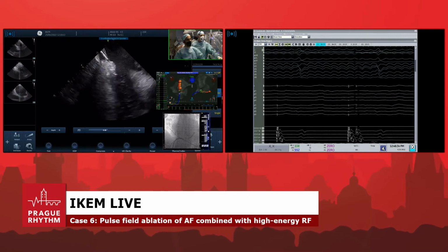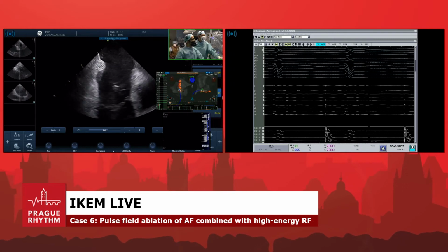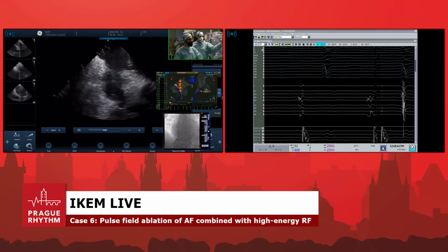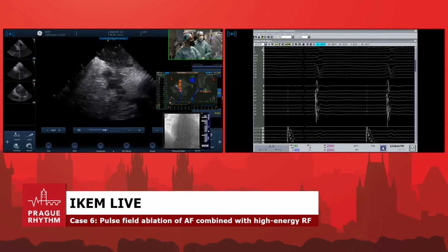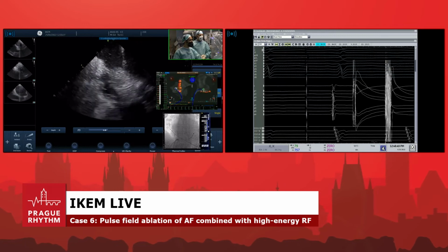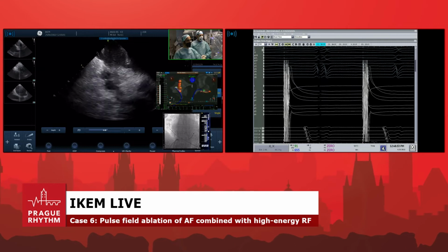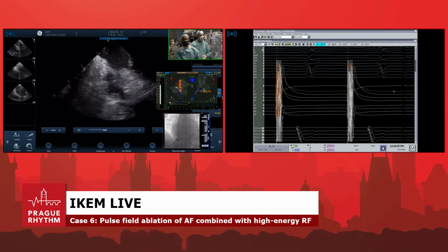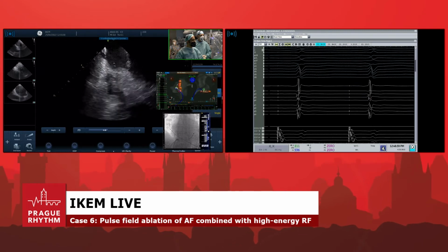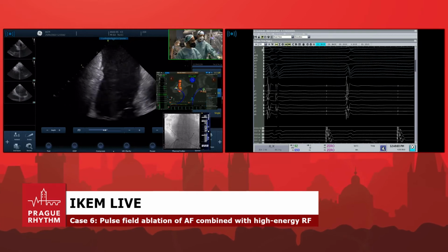I believe we can now map, just to show you how quick the map is. Now I'm just going to go a little bit lateral to the line. But also do the map during CS pacing. We have to move soon to the other lab, please. Can you show the vector, if you have something important to show? We just want to show you one little thing. Can we pace CS? Yes, that's the vector. Pacing CS. Okay.